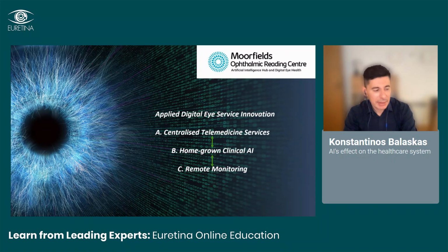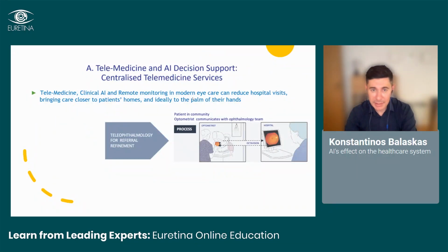But we view it more as a continuum of providing services that range from telemedicine, teleophthalmology, that relies on expert human graders, expert human clinicians for interpreting images, moving on to AI-assisted interpretation, and then moving on, hopefully, soon to remote monitoring that will be at the patient's home and potentially even in the palm of their hands.